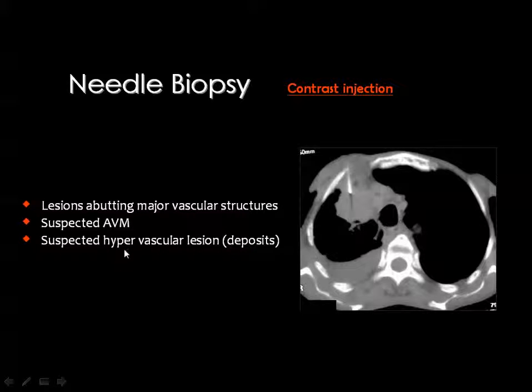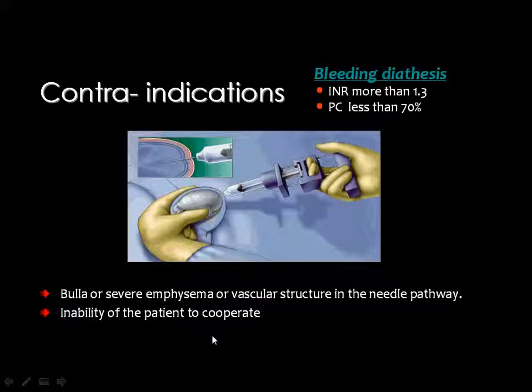Also, for suspected hypervascular lesions like the deposits or some malignancies, you may need to inject contrast media sometimes, but this is not the usual case.